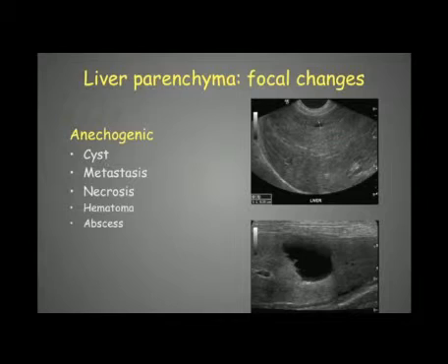So mostly it will be because of cysts, but we can have some metastases that will look like cyst-like lesions, or necrotic areas, hematomas or abscesses that will also be very anechoic on ultrasound.